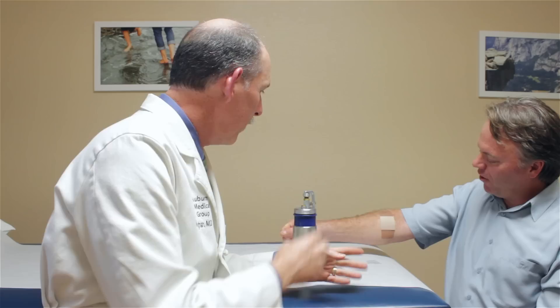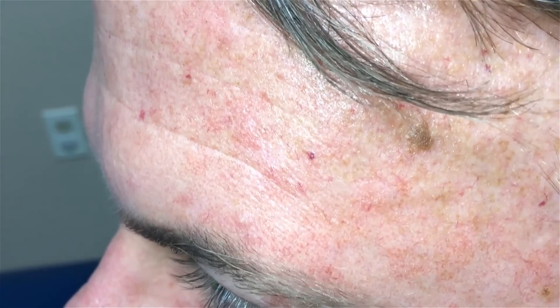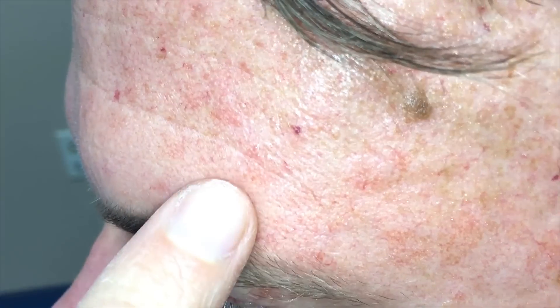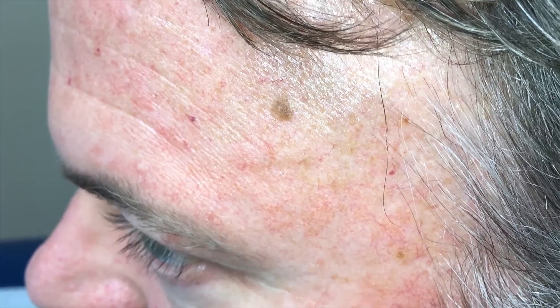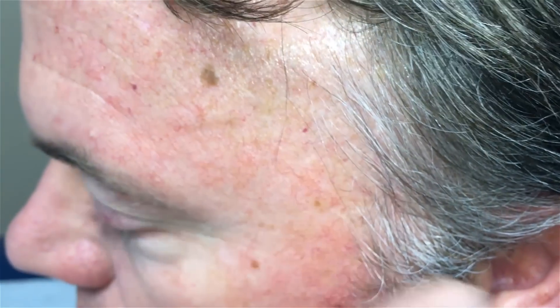We got your arm all taken care of, got a little bandage on it there, and now we have these actinic keratosis lesions. So lots of keratin being produced. Oftentimes they'll have a pink base to them. I feel that one. Do you feel any others, Eric? No, it's really just localized to that area. Oftentimes we'll get them on this area here on the cheek, on the temples, on the tips of the ears. Although you have hair on yours, you're okay.